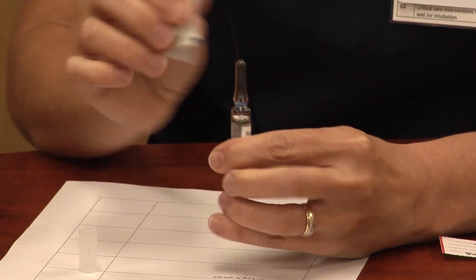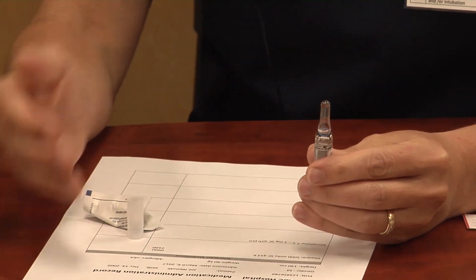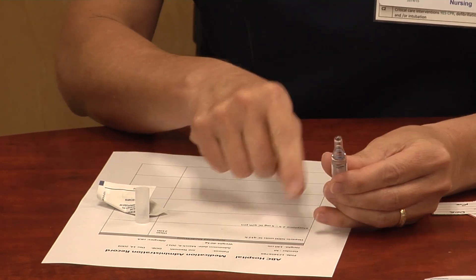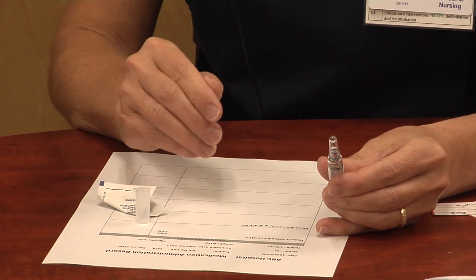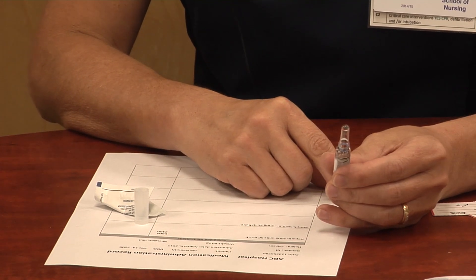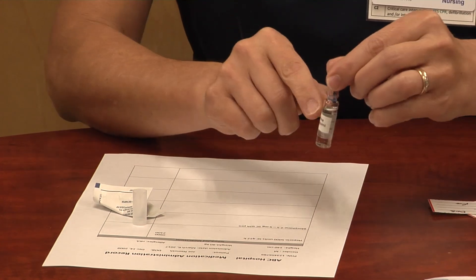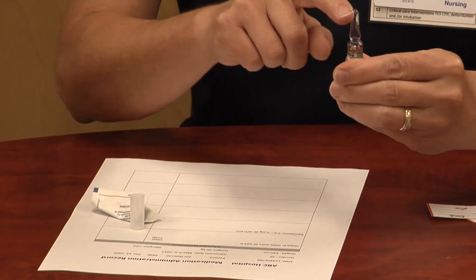The first thing you need to do is check your MAR, take your medication out of the medication system, and make sure you have the right patient and the right drug — all of those rights, whether there are six, ten, or twelve rights, as the literature varies. In this case, everything is correct and I've taken my medication out of the medication system.